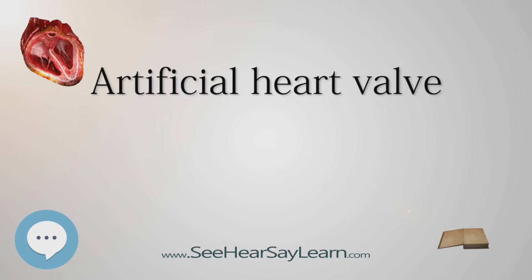Modern mechanical valves can last indefinitely, the equivalent of over 50,000 years in an accelerated valve wear tester. However, current mechanical heart valves all require lifelong treatment with anticoagulants, blood thinners, e.g. warfarin, which requires monthly blood tests to monitor. This process of thinning the blood is called anticoagulation.